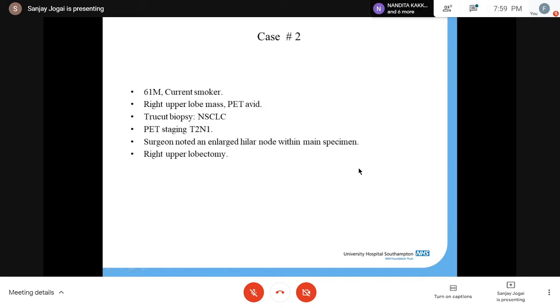Before you go on to the next case, I would like to share my experience with you, that CD56 is really the one that doesn't ever let you down generally. So I have also found, and I've been advocating it to all my juniors. Absolutely, Dr. Roy. In 2013, I attended the Pulmonary Pathology Society meeting in Grenoble, and the president Elizabeth Brambilla did the main talk, and that's one take-home message I got from that talk.